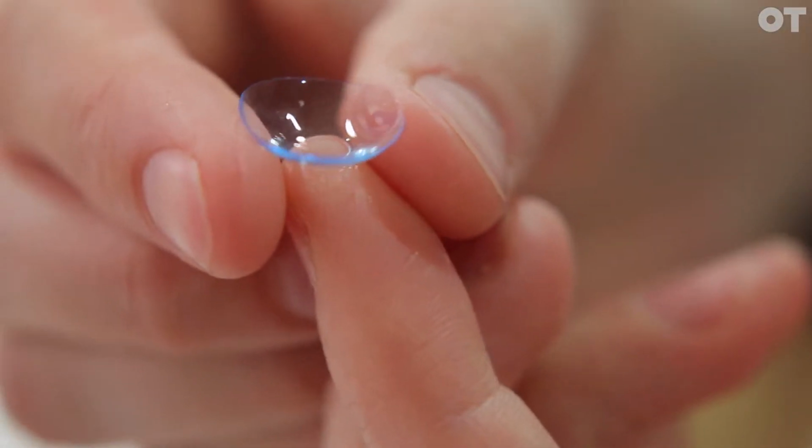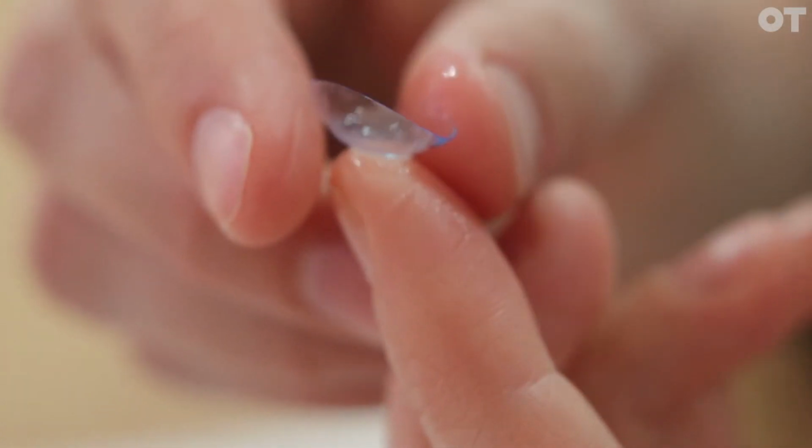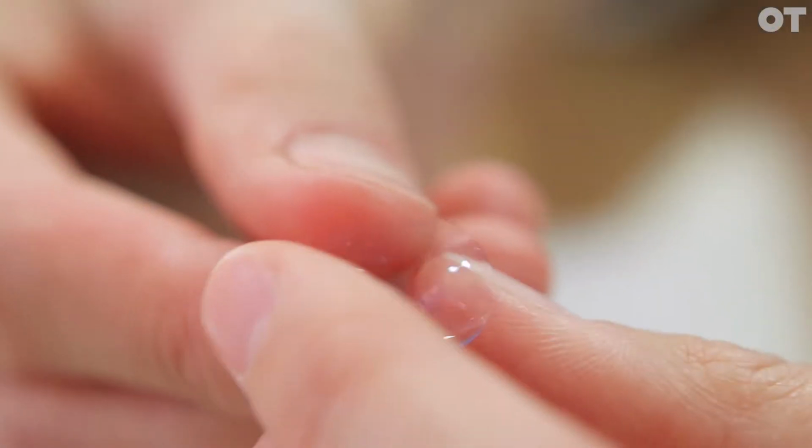The minus lens, you put that on the tip of your finger and you put that towards the eye and it stays whichever angle you're at. The plus lens, let's say it's +6, you put that lens on the tip of your finger. The moment you raise your finger, it drops off or it starts to slide down. Because it's thick in the middle, the weight distribution is different.